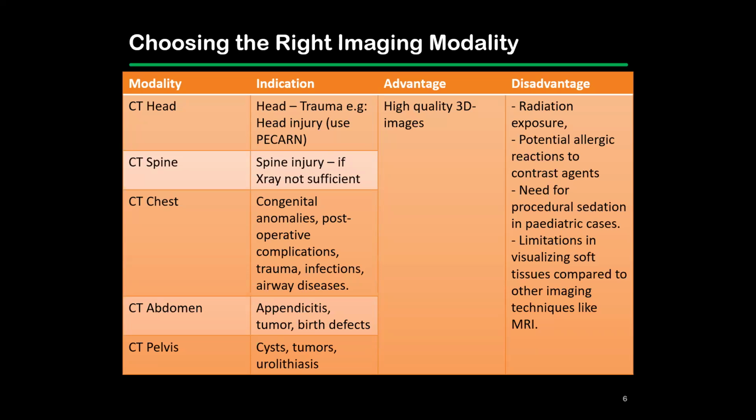So the advantage of this modality is that it's high quality. It gives you 3D images. However, the radiation exposure is much higher compared to an X-ray. Again, there is a risk of allergic reactions to contrast agent, especially when you're ordering a contrasted CT.